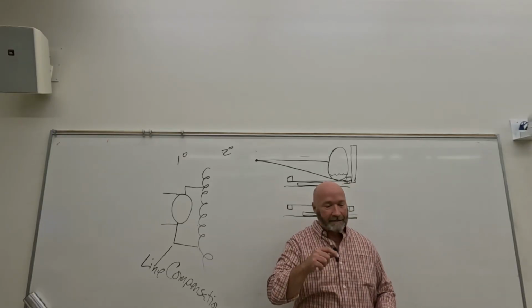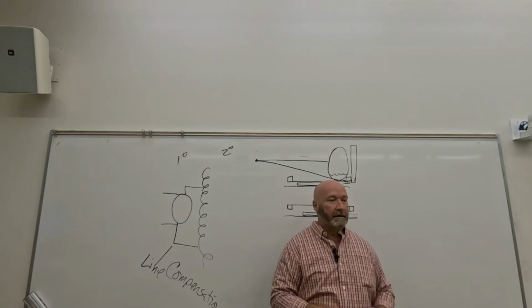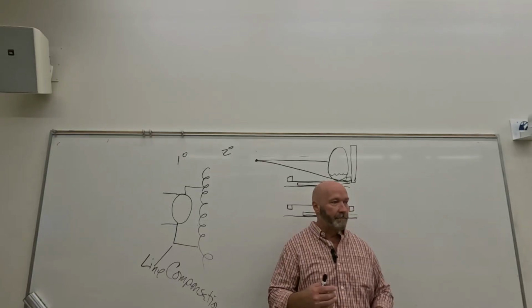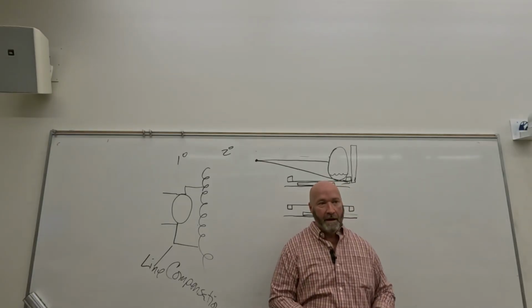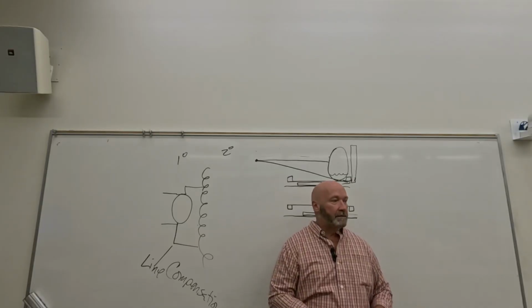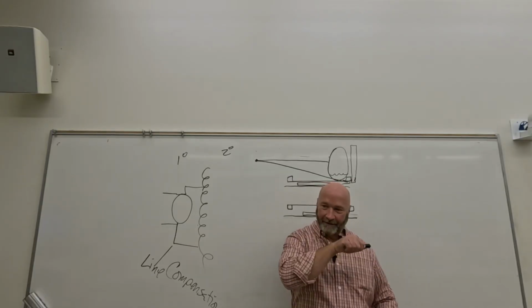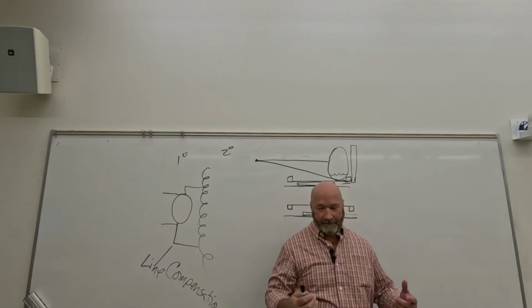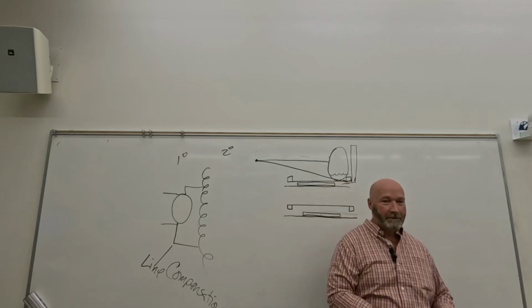Even the glass at the control panel is leaded glass. And I haven't done this with a digital image receptor, but back when we used screens and films, I wanted to see how efficient that leaded glass was. So I pointed, I don't recommend y'all do this. I say that a lot, but I don't recommend y'all do this.